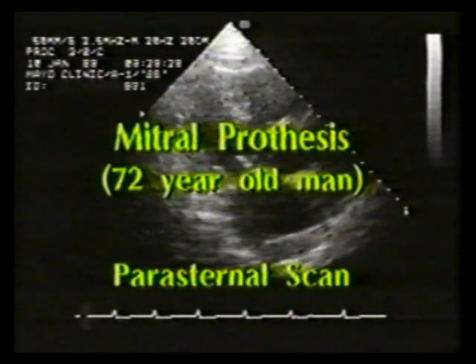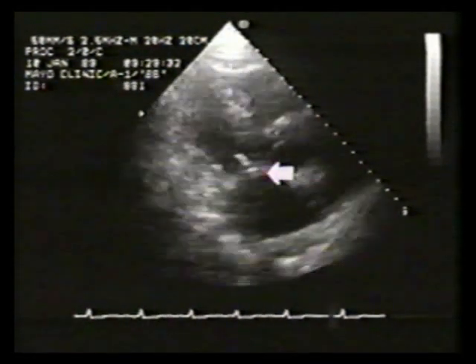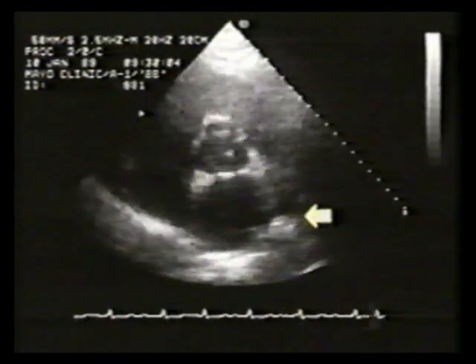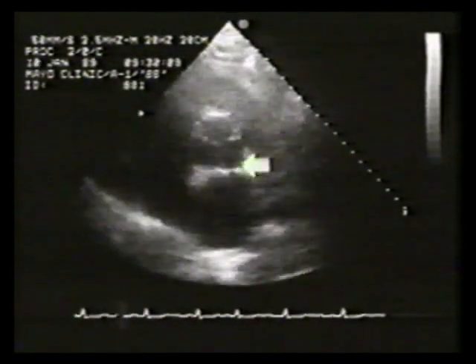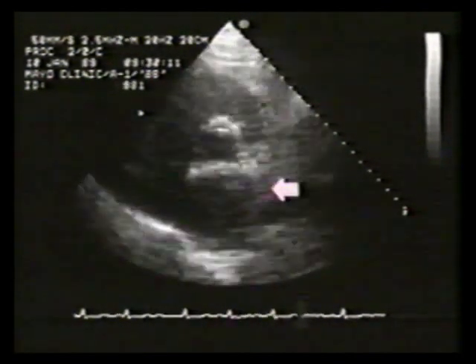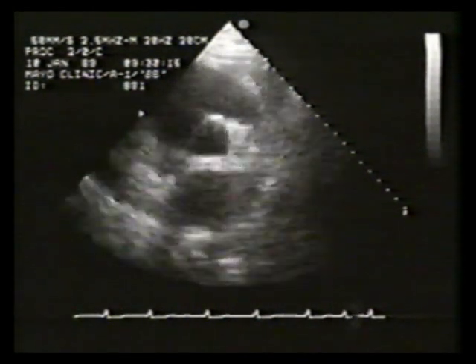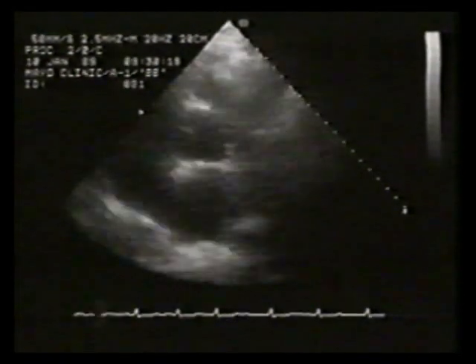The next example is that of a 72-year-old man with a mitral heterograft. The transthoracic examination is shown for comparison with the transesophageal echocardiogram, which will follow. Note that the left atrium is free of obvious echoes. The transesophageal echocardiogram was performed because of increasing Doppler velocities across the prosthesis, suggesting stenosis.